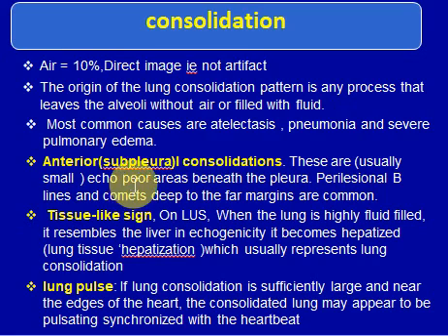Also called the subpleural consolidation. This is a small echo-poor area below the pleural line. Tissue-like sign on the lung, highly fluid filled, resembling the liver in echogenicity, becomes hepatized. Lung pulse: if the lung consolidation is near the edge of the heart, there's no sliding, it appears like pulsating, synchronized with the heartbeat.